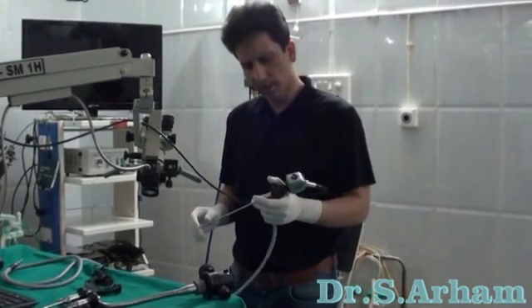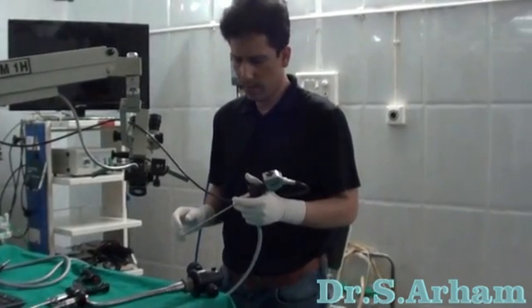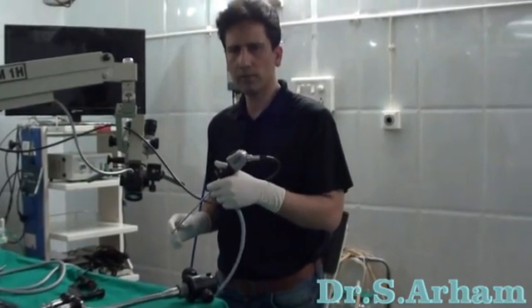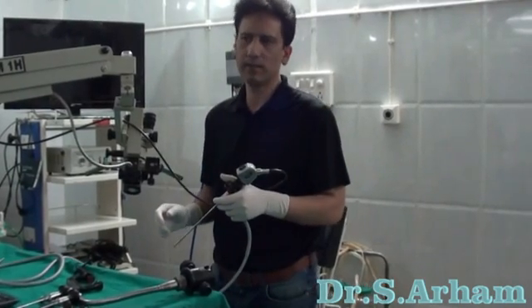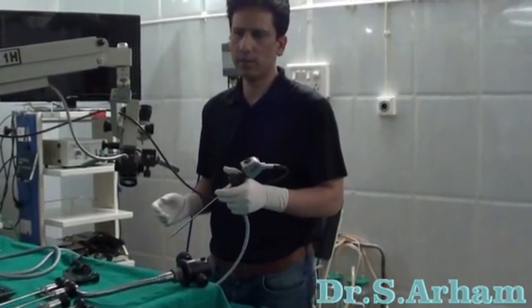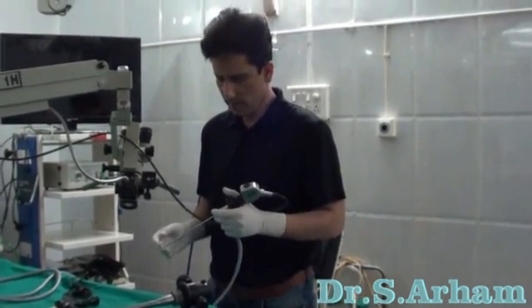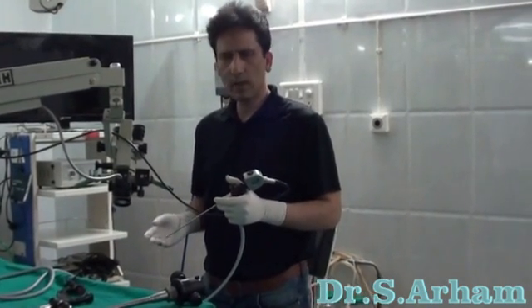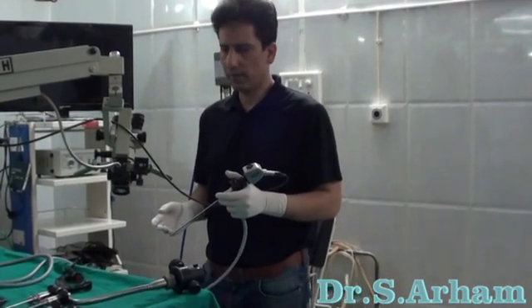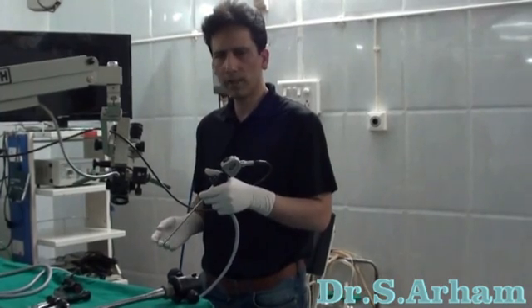I have been doing endoscopic ear surgery for the last two decades. Initially, I was holding the endoscope and doing small surgeries, and I got success in surgeries like repair of traumatic perforations or simple tympanoplasties. But when you go for complicated surgeries like mastoid explorations or cholesteatoma surgery, you have to have both hands free.